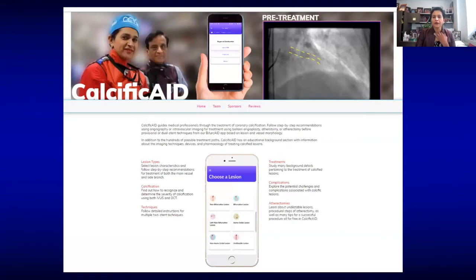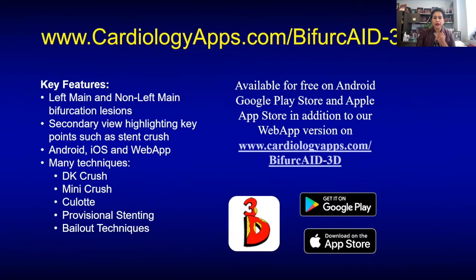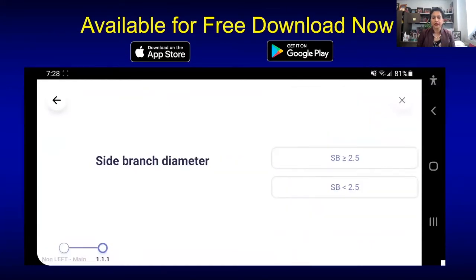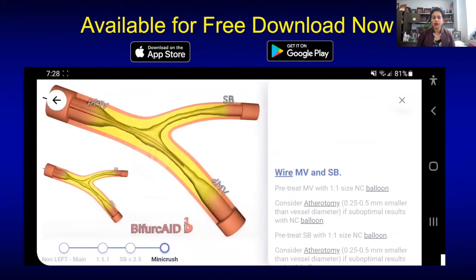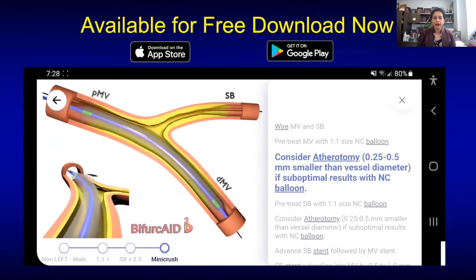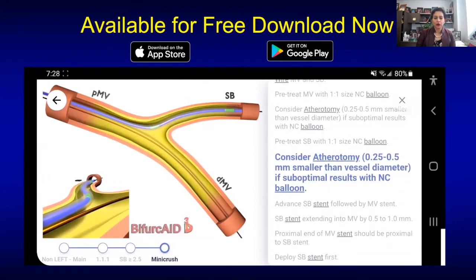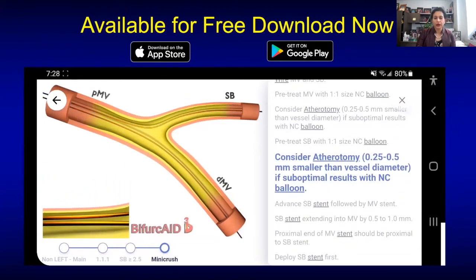So how to take care of a calcific lesion? We actually have a calcific app that is free to be downloaded. We tell you the various techniques, how to do orbital atherectomy, both for bifurcation and non-bifurcation lesions. Various apps are available on cardiologyapps.com. This was a Bifurcate 3D app where we are showing animation of how to do a bifurcation technique of whatever kind of technique that you want to learn. Here we are showing a mini crush technique.